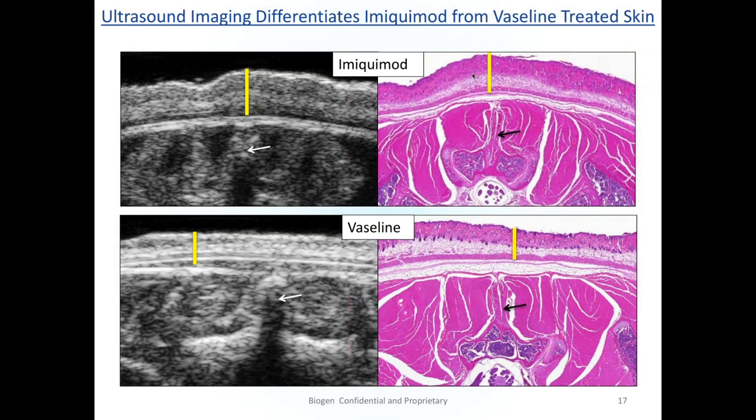So that's a time, it didn't actually come up in these models, but for example, with the tweak model, if we'd wanted to look at the mice, we would have removed hair once, and then we would have avoided doing any imaging 3 weeks after that first hair removal, because we know that would be a blackout point when there would be a lot of confounding effects with the hair growth going on in the skin.